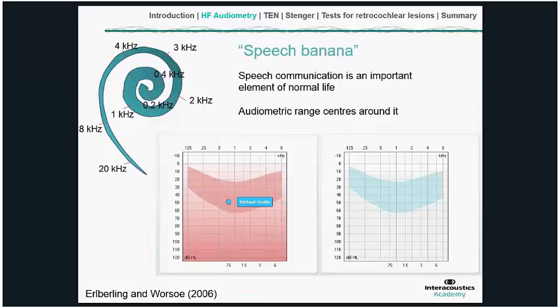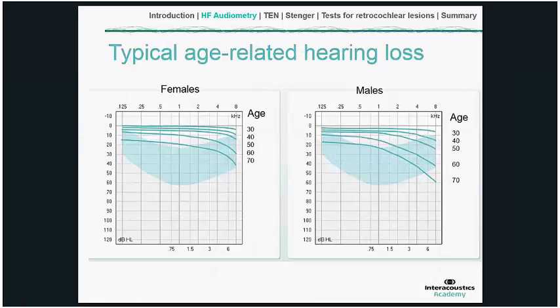It's around about a 30 to 40 dB dynamic range that we see here for the right and left ears separately, which would correspond to the range, in both frequency and level, in which quiet to normal conversational speech occurs, as well as other day-to-day sounds.